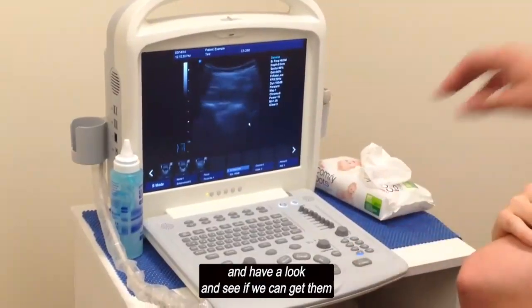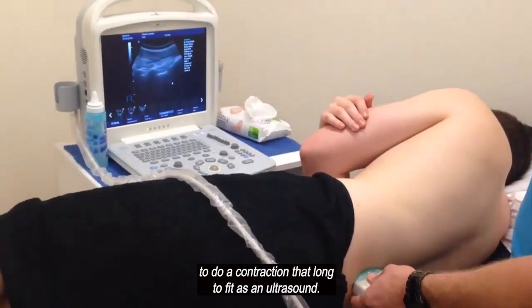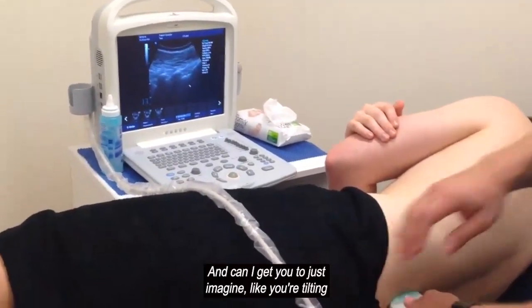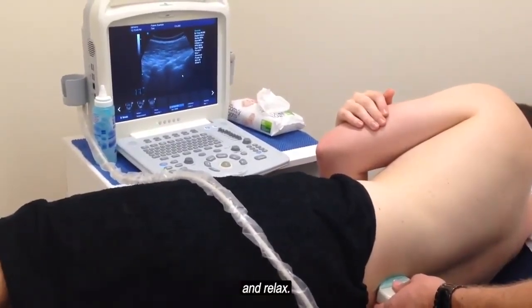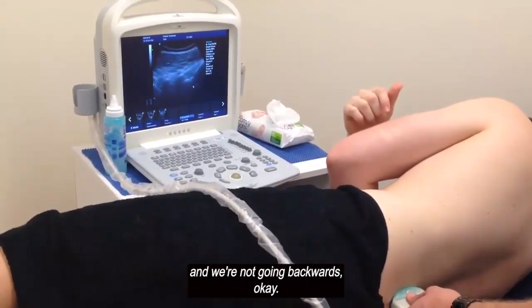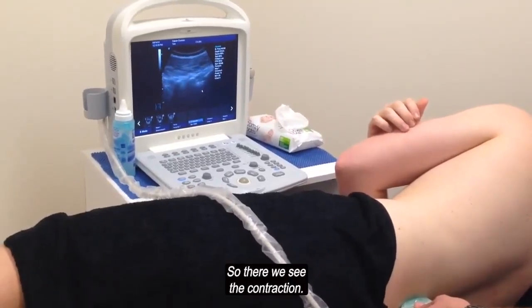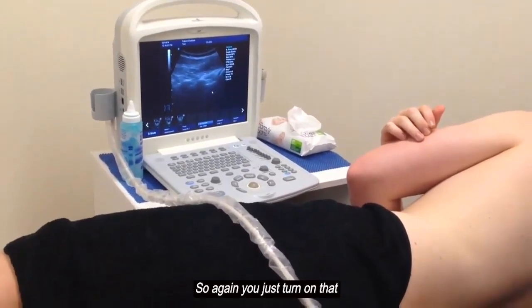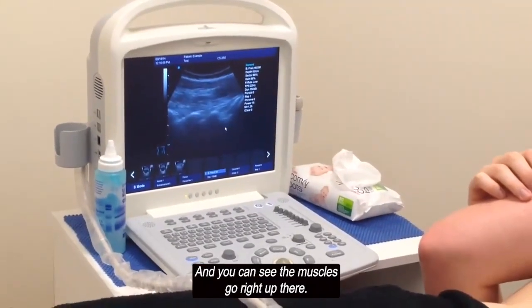and we'll see if we can get Ben to do a contraction of the Multifidus and hold it. Could I get you to just imagine like you're tilting your pelvis back towards us, and relax, and one more time. Now we're not getting backwards, sorry. Yeah, and relax again. Yep, so there we see the contraction. Just relax there. Okay. So again, I'll get you to turn on that Multifidus just by tilting your pelvis. Great. And you can see the muscles swell right up there.